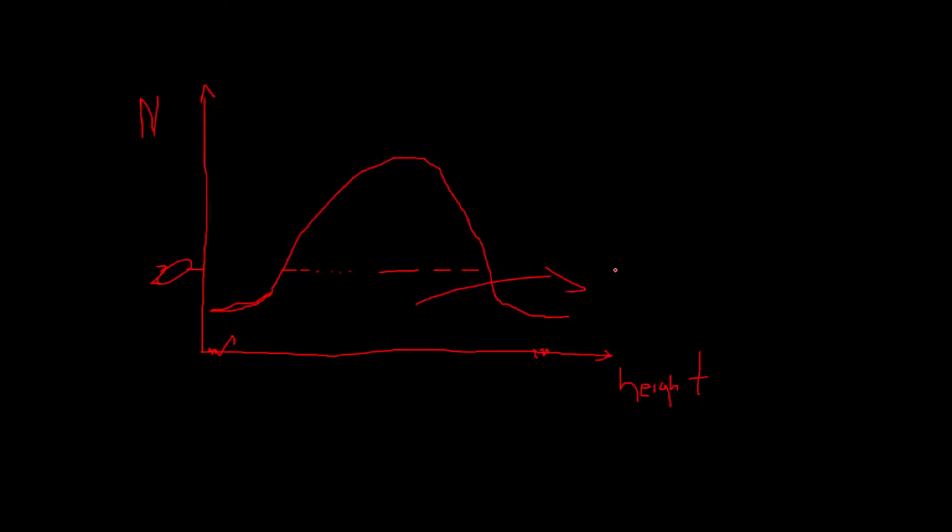The same thing is happening with the red blood cells. You have the red blood cells that are extremely small, you have the red blood cells that are extremely large, and the majority of them are within normal range. So you have this standard deviation, or this distribution of the different sizes. So it means that if you get a lot of red blood cells that are very large, this graph is going to be spread much wider. If you have a lot of red blood cells that, most of them are within the normal range, it may become narrow, and so forth and so on.